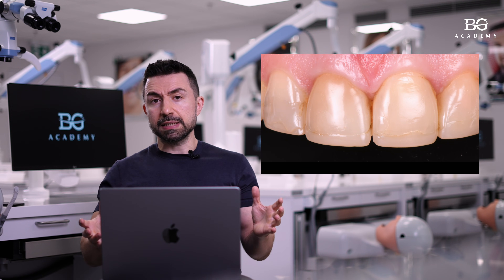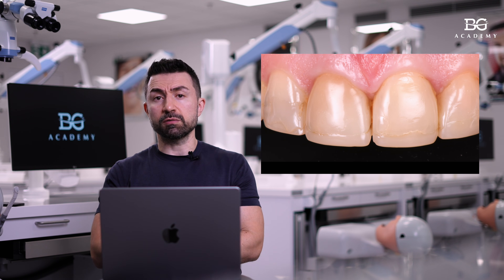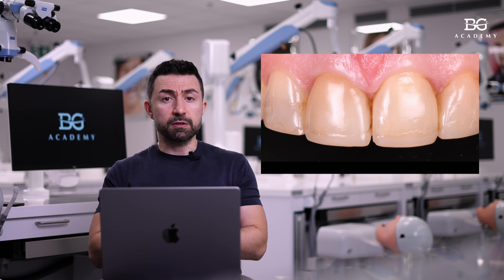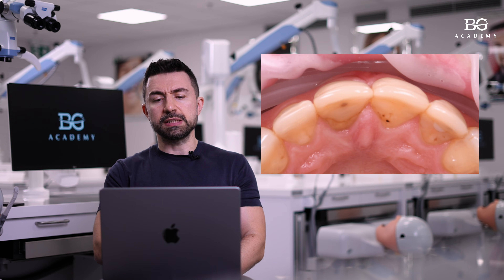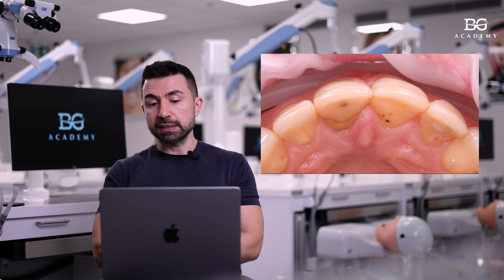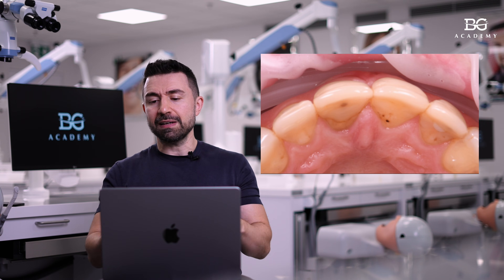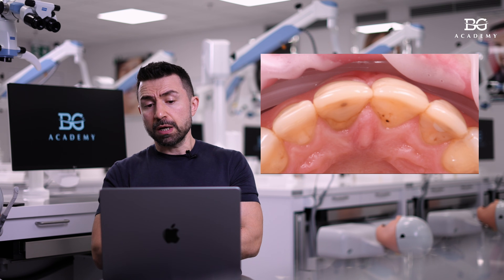Here you can see two central incisors filled with resin composite. This is a case of full mouth rehabilitation where we raised the vertical dimension of occlusion. That's why some teeth were prepped for semi-crowns or three-quarter crowns. One tooth is endodontically treated and the palatal surface is completely covered with composite with a fiber post, indicating a crown. The adjacent teeth were also prepped with palatal coverage because of function, static and dynamic contacts.